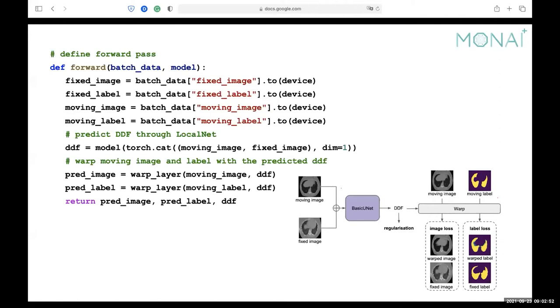This shows the whole forward process. Given the batch data and the model, we first concatenate the moving image and fixed image as input into the model. We get a DDF, then use the warp layer to warp the moving image to get the warped image, and also warp the moving label to get the warped label. The outputs are the predicted image, predicted label, and DDF.